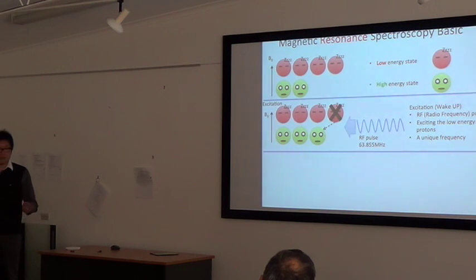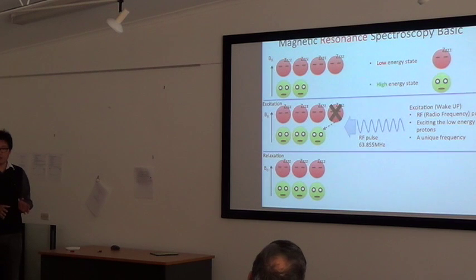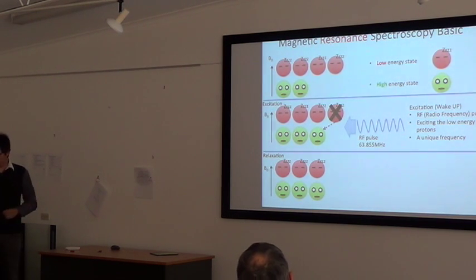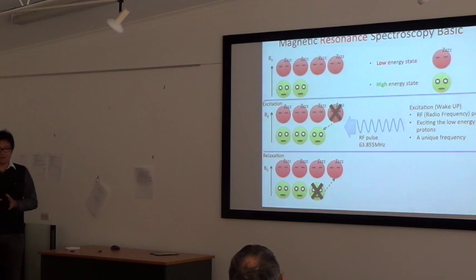And once they wake up, we switch off the wake-up signal, and we come to the third important phase, which is relaxation, getting relaxed. So remember the person who just woke up, you want to go back to sleep. Why? Because of the external magnetic field, because of my talk.